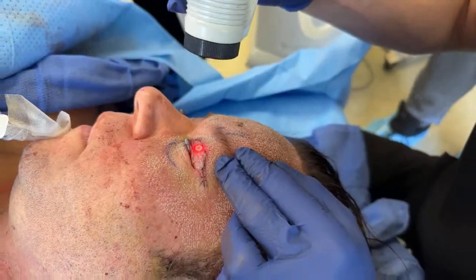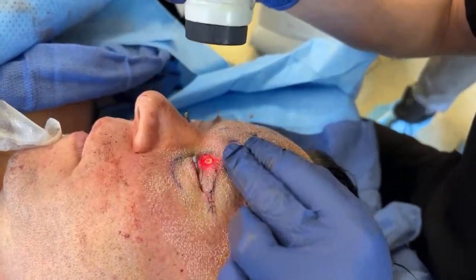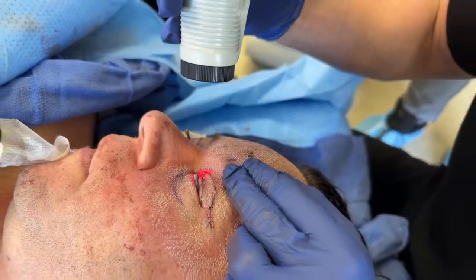See the tightening here? Will his face be sore and burnt afterwards? Yes, it will feel like a sunburn, guys.